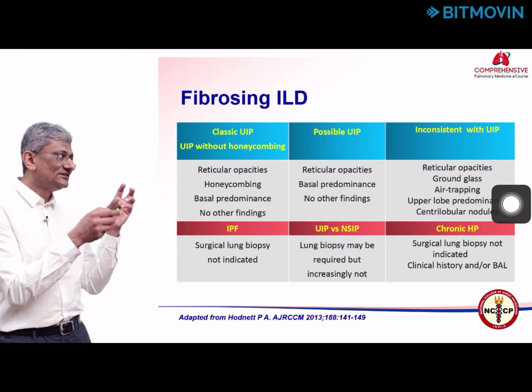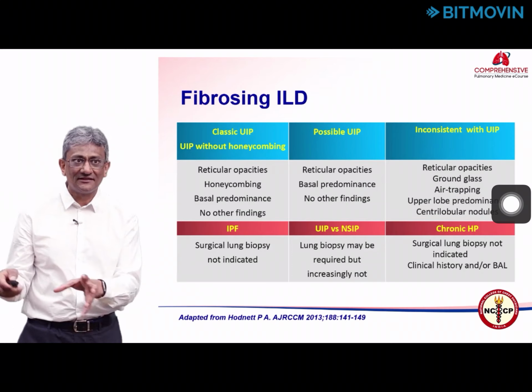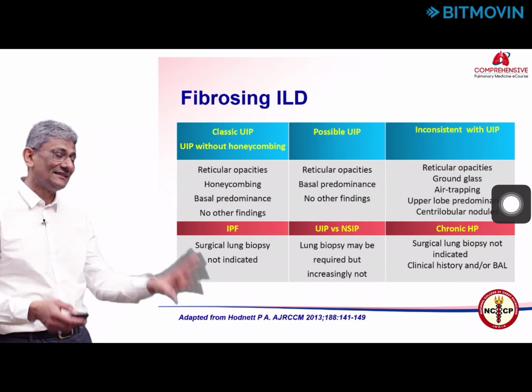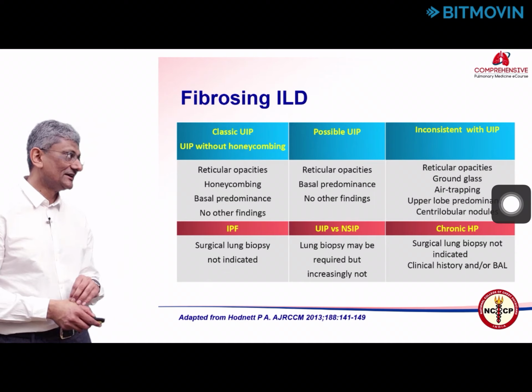And we need to diagnose possible UIP as against an NSIP pattern, because both of them pretty much look the same. And if you are not able to make out the difference, then a surgical lung biopsy typically becomes required.